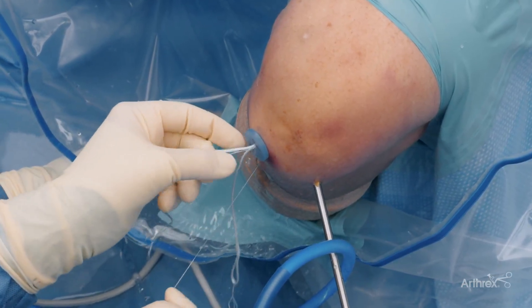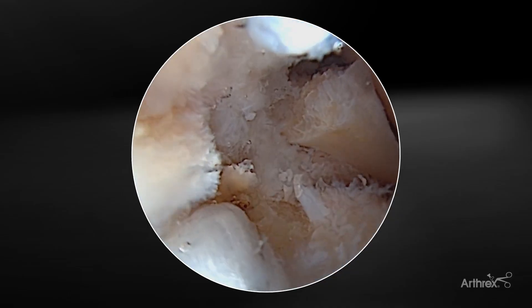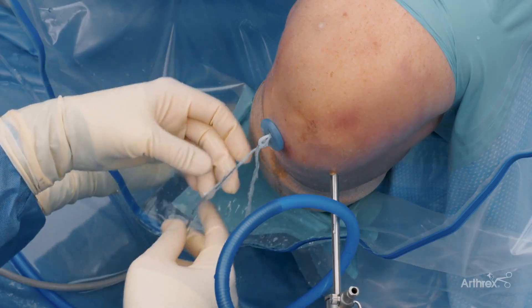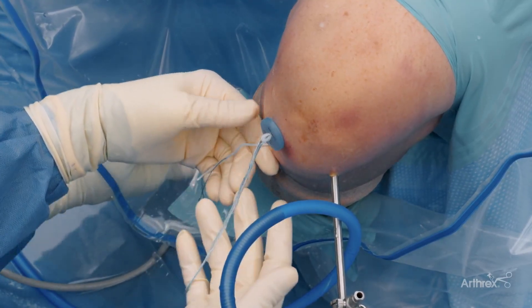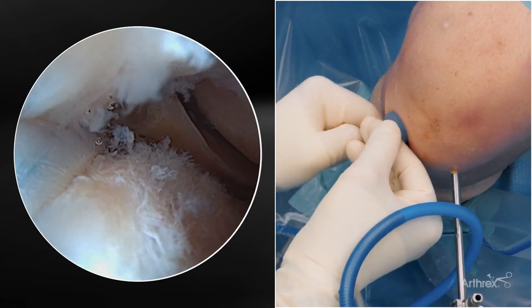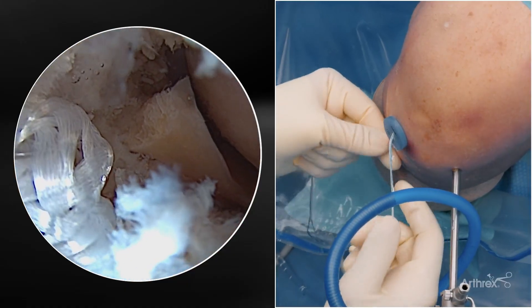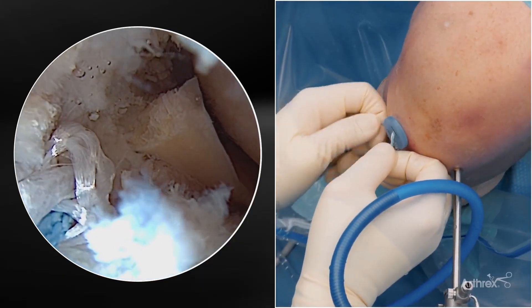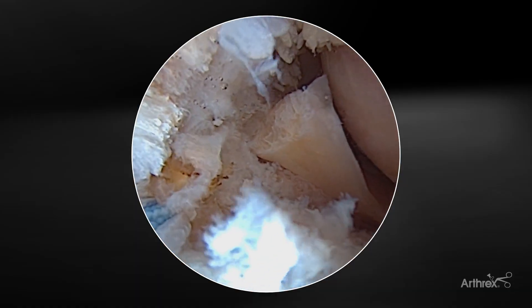We're now going to deploy the SutureLock into the knee. When we watch it come into the tunnel, you can see that the end of the splice and sheath is coming in and we just slowly deliver it into the tibial tunnel. Once the fiber link is out, I then pull the sutures so that we can manage deployment of the SutureLock against the tibial plateau. At this point the SutureLock sheath is almost fully deployed into the tibia. I generally have my assistant hold the scope at this point so I can manage deployment of the SutureLock sheath.